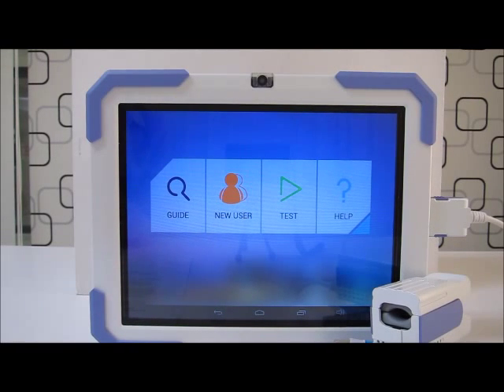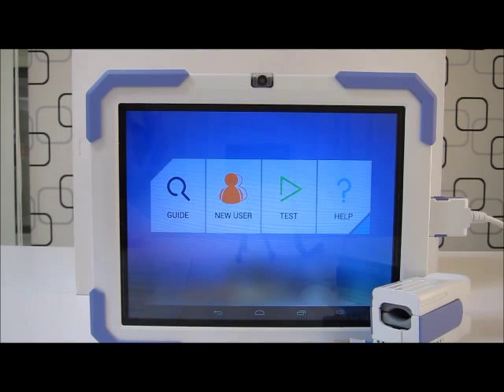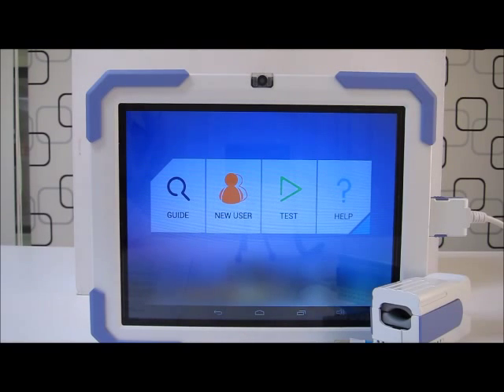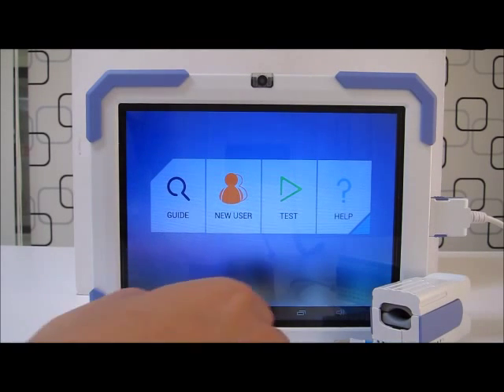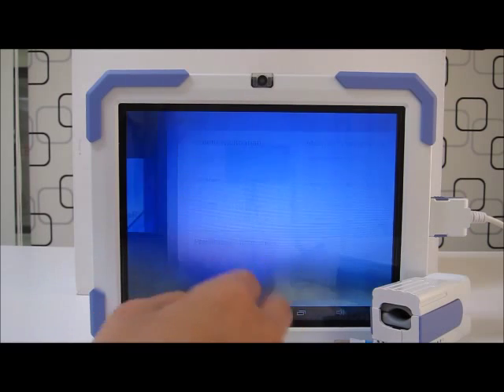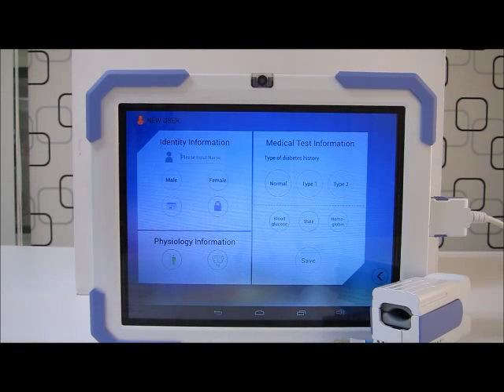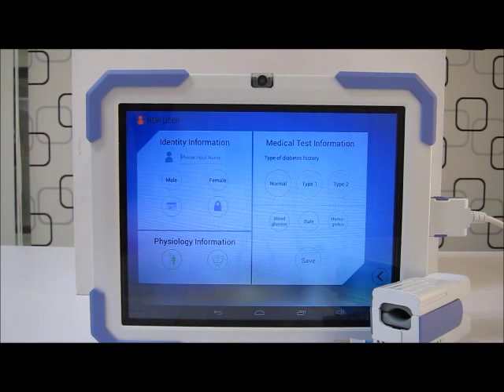Hello everyone, I'm Clyde and today I'll be guiding you through how to create a new user for our Ethers health perception computer. Right now, as you can see on the main screen, there are four icons. Press 'New User' right here. You will see a lot of information — many of you will ask if this is necessary. Yes, it is necessary.